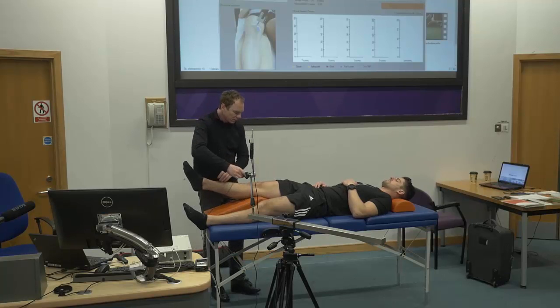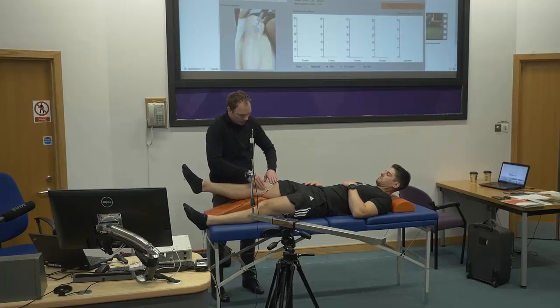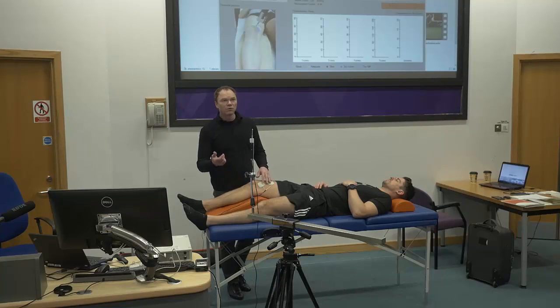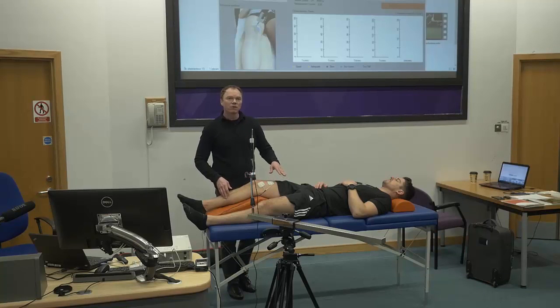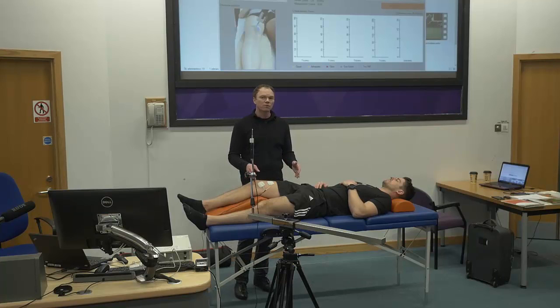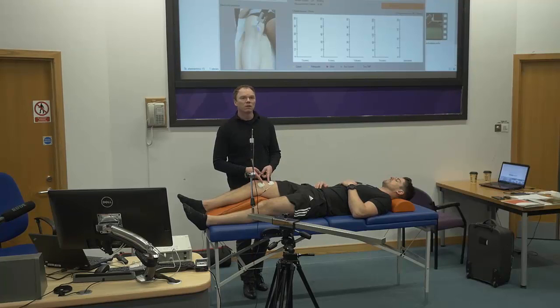I put one electrode higher and one lower — one proximal and the other distal from the measuring point. The space between the electrodes is a few centimeters, depending on how big the muscle is. The standard size of 50 by 50 millimeters is used in most cases and is good enough for most big muscles. You need to leave enough room for the sensor to be positioned. For a long muscle like rectus femoris, you leave up to one electrode width — five centimeters — as the space between electrodes. The orientation of the electrodes will not affect the result.